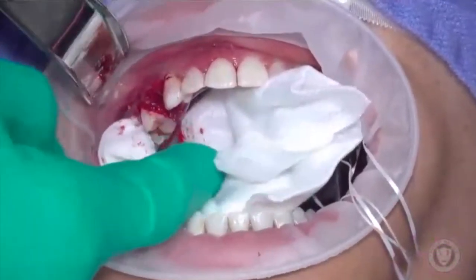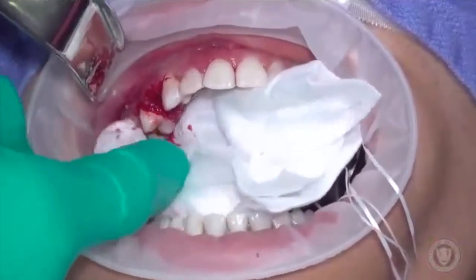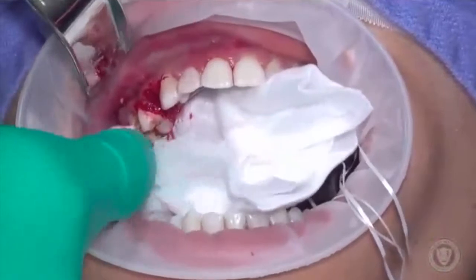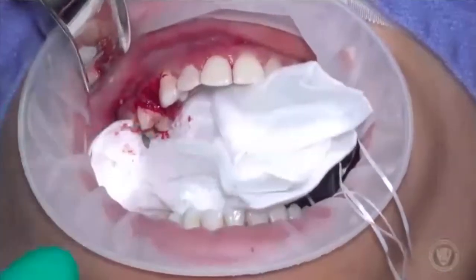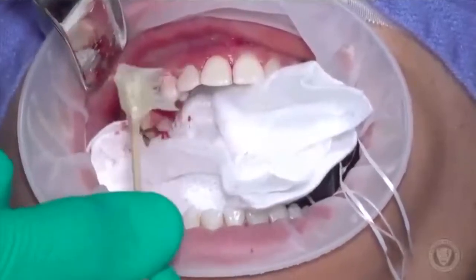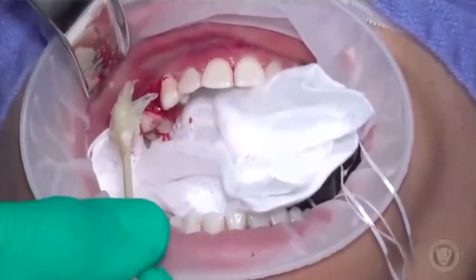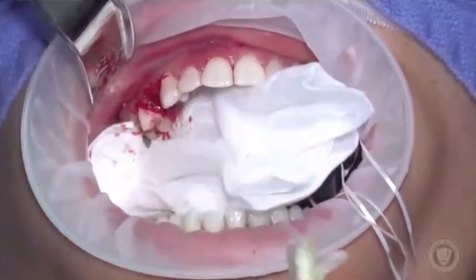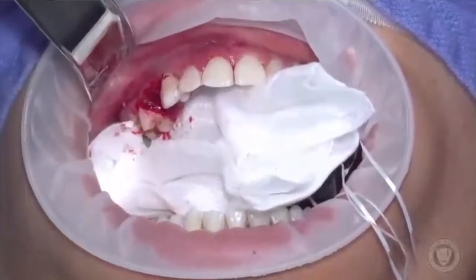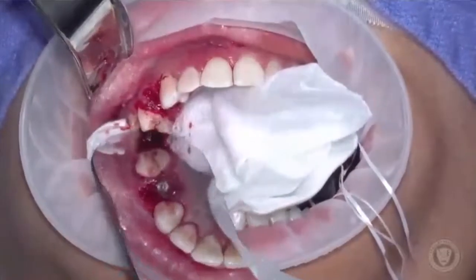We just used super glue, and normally we don't have the distinct advantage of having the patient under general anesthesia, so normally we'd have a patient that's moving around. What we do is follow it up with Vaseline — we're gonna lube the cheek, the buccal vestibule, the palate, anywhere where we think they might get stuck. But first, let me show you on the mirror what the glue looks like before we close up.